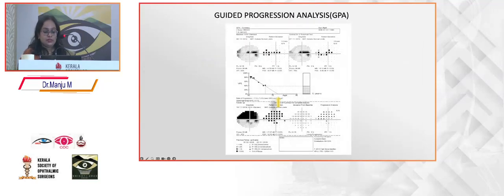So this patient had taken the first visual field and second visual field, and the patient was lost to follow-up for some years, and now this is the patient's visual field. So if you extrapolate the data over the 5 years, the patient is going to go blind. It's almost 0. So if the same rate of progression is happening over 5 years, the patient is going to become blind. So the machine, or the program, is practically telling you that you need to do some intervention, either increase your medication, do a laser or surgery, to reduce the rate of progression at this point so that the vision can be preserved for the patient.